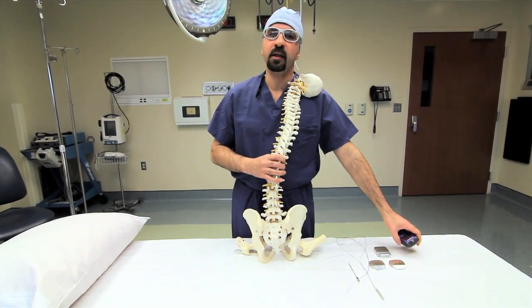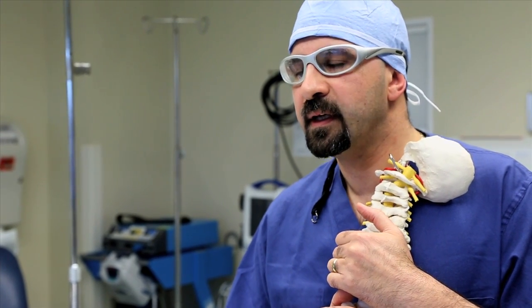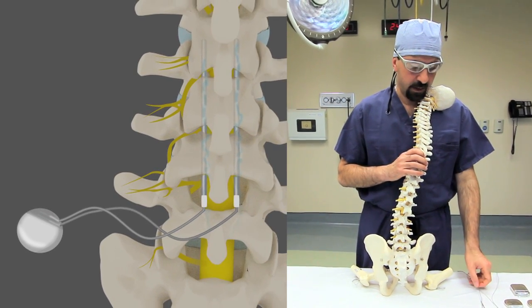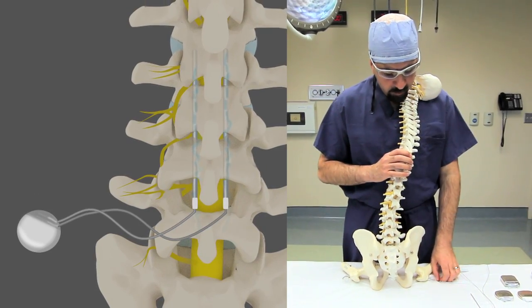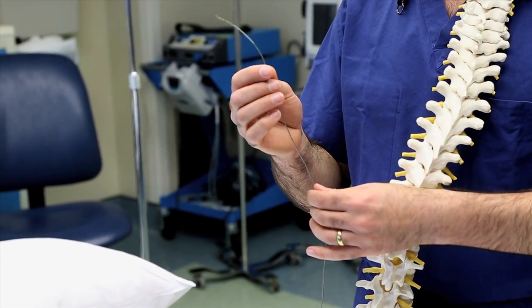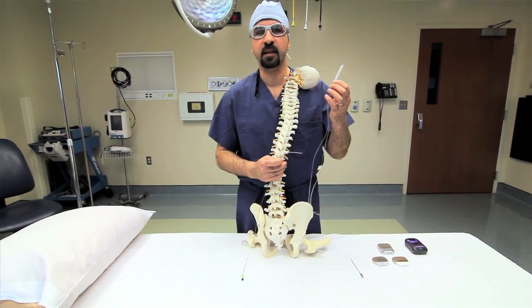Let's say the patient came back after the trial and says, I had 100% relief of my pain with the spinal cord stimulator trial. At this point we offer them to proceed with a permanent stimulator. We can do a permanent stimulator using a percutaneous lead, which is the lead I have in my hand, or using a paddle lead, which is a surgical lead.